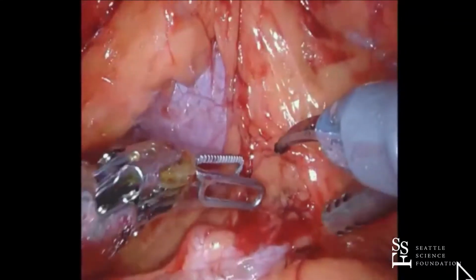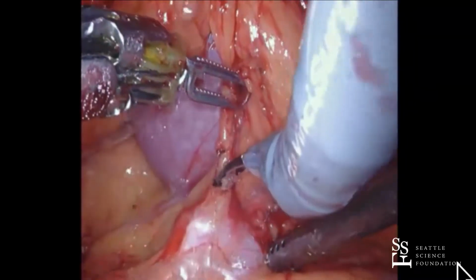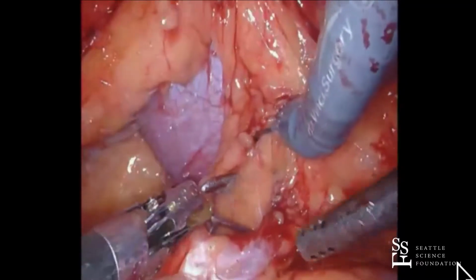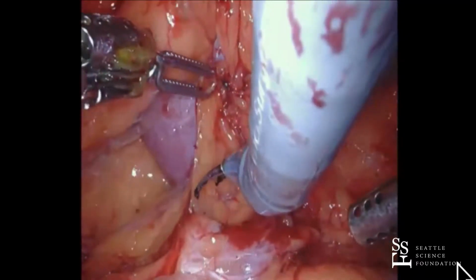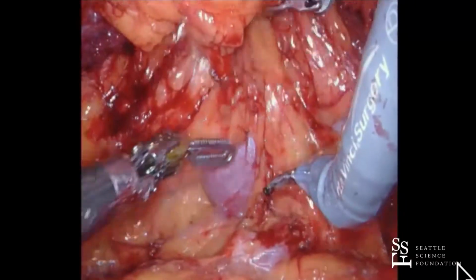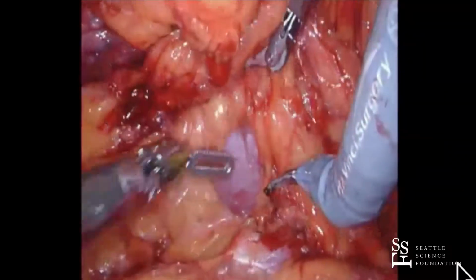You can do it, but that's what Jim was saying, is that when he was doing a three-arm approach with the Si robot, he would have to use one hand to push the kidney up, and now he's dissecting the hilum out with one hand. So it's doable, it's just not as nice as when you have the fourth arm and you lift the kidney. We have a couple. Still having conflict there, though.